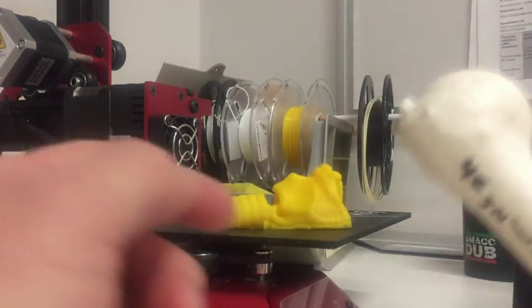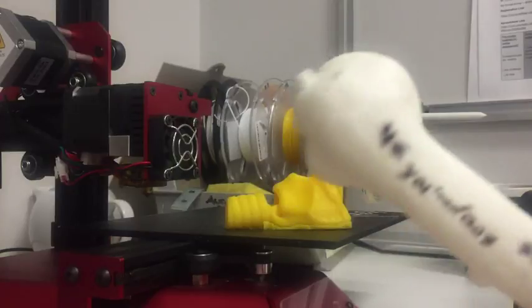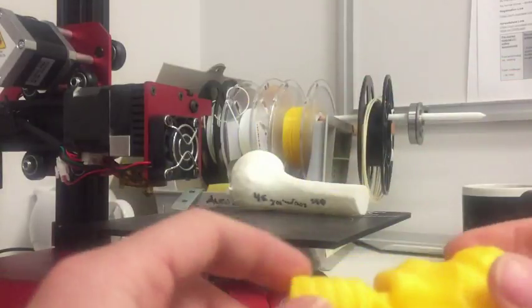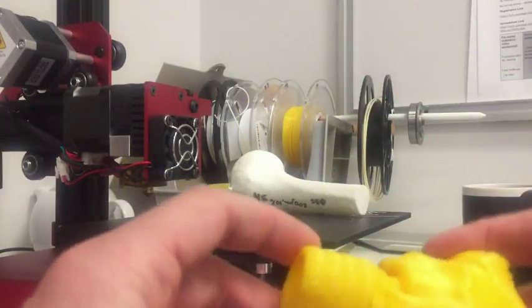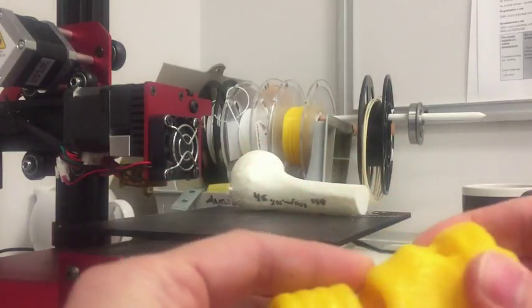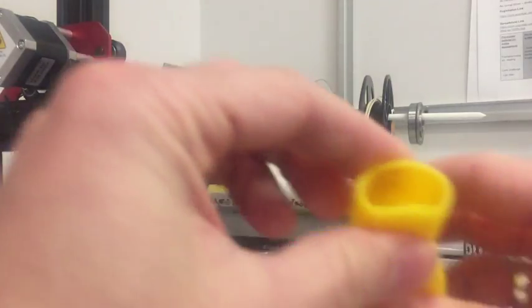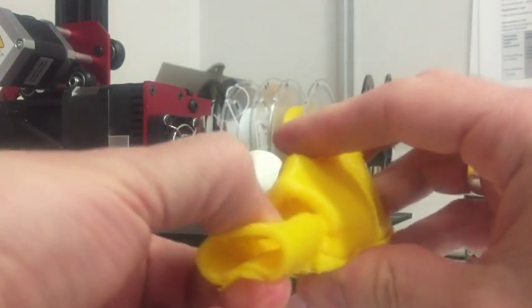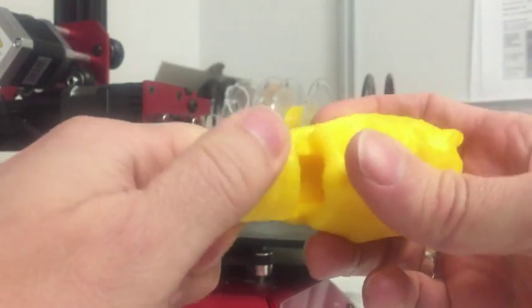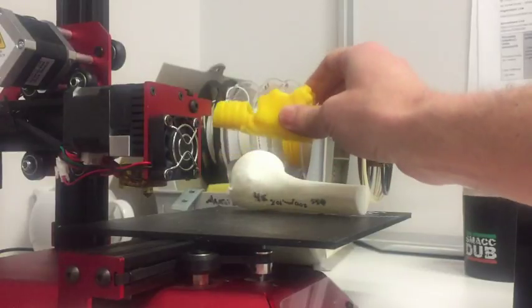So certainly, when you're talking about an IO trainer, you can make that out of PLA and it's nice and hard, ready for taking that IO cannula in. And for something like an emergency surgical airway trainer, depending on how you set up the print, you can use flexible materials such that the cartilage is still relatively firm and has the landmarks that you need it to have, but the soft bits are still soft. So, for instance, that trachea there is still compressible, so if you press too hard, you can actually occlude it, and it can add just that extra element of realism into your part task trainer.